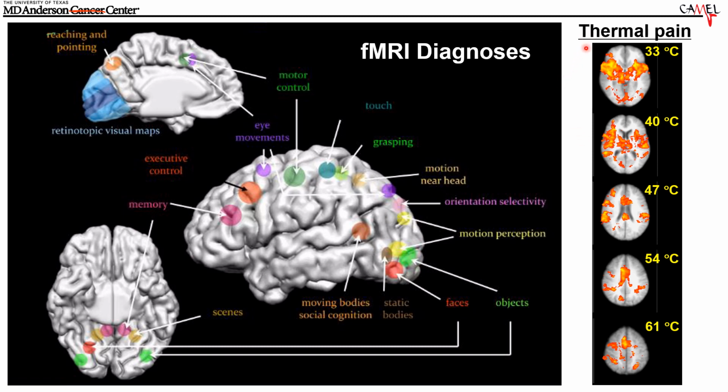And then here's a study conducted by Janet Husband in the UK, the United Kingdom, where she was studying the effects of pain and where different parts of your brain consume oxygen and become metabolically active when experiencing pain. In this case, she just placed the patient's hand in water that was, well, mildly warm at 33 degrees or extremely warm, very hot at 61 degrees Celsius.